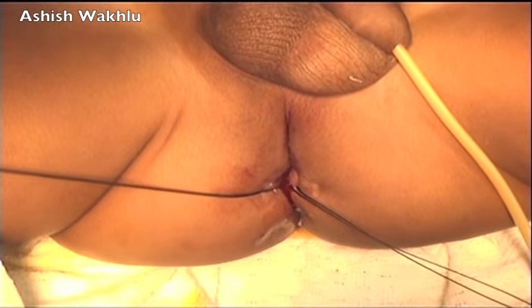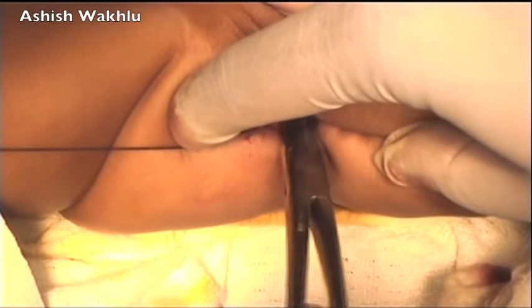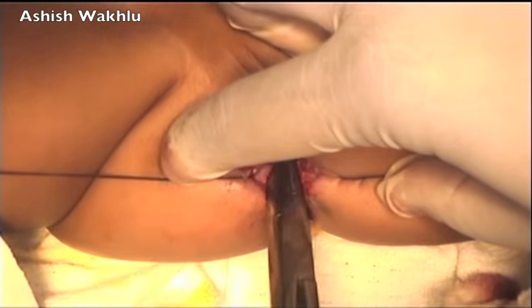During this dissection, two things are important. One is to stay strictly in the midline, and second, to stay parallel to the operating table. In a patient like this where a previous operative intervention has been attempted, things are not so easy as in a patient where the first operative attempt is being made. The scar tissue extends deeper than is apparent from the surface, and therefore the dissection lasts longer.